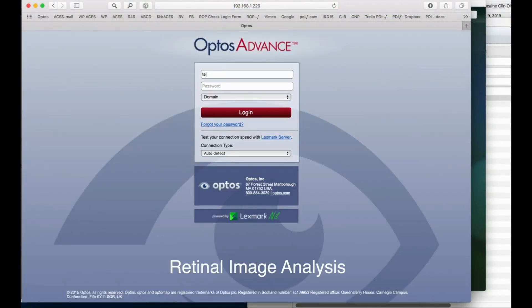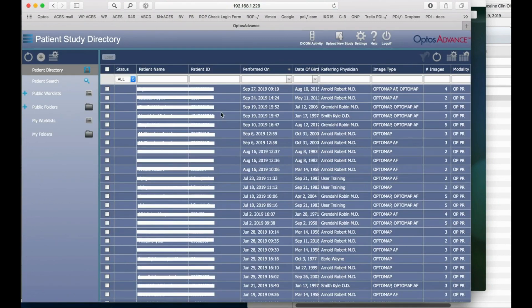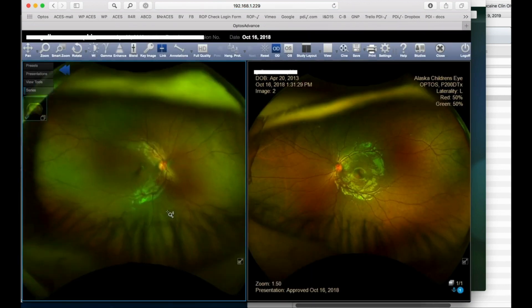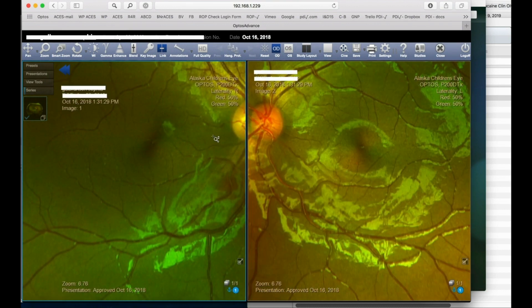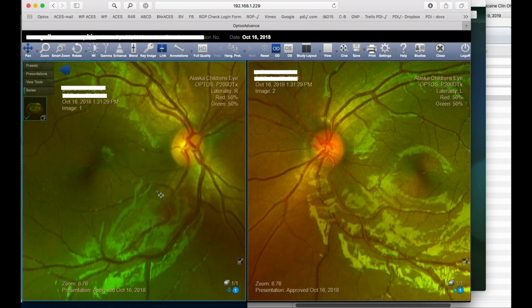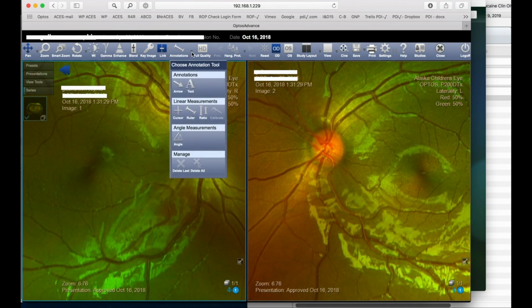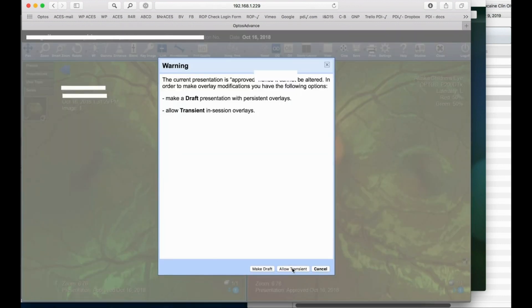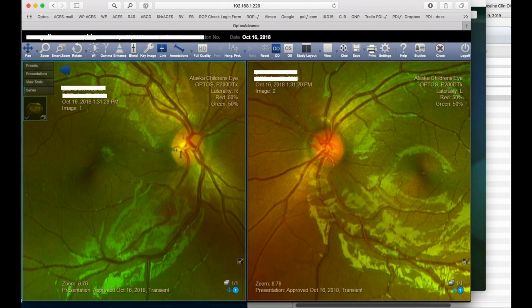Using accompanying software, image analysis of the optic nerve images is possible. Magnifying, centering, and then selecting the ruler tool to draw the horizontal diameter and the vertical dimension of the optic nerve.